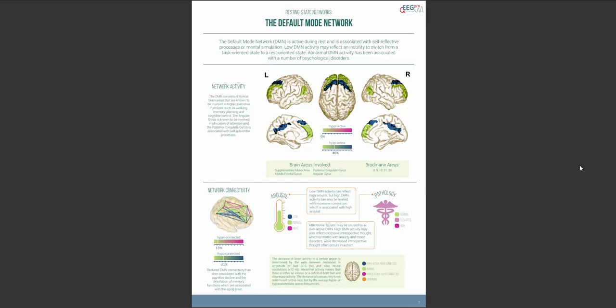The first network that is depicted is called the default mode network. It consists of frontal and parietal areas as well as the posterior cingulate area. In the top half of the page, you will see that areas in the default mode network have deficiently high or low activity, show normal activity or a mix of high and low activity. Studies in which EEG and fMRI are used simultaneously have shown that high brain activity as measured with fMRI is associated with high power in high frequencies and low power in low frequencies when looking at the EEG signal.